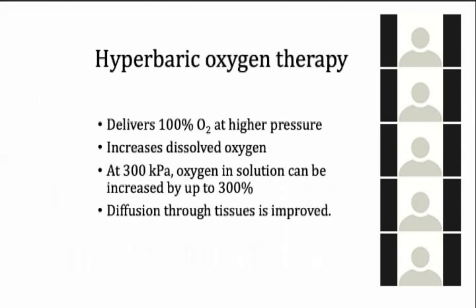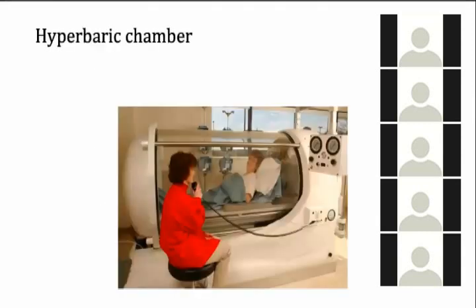Okay. And there's another, this is the last slide. There are hyperbaric chambers where you can use oxygen in a high pressure environment to increase the delivery of oxygen sometimes. Okay. So this is one such chamber.